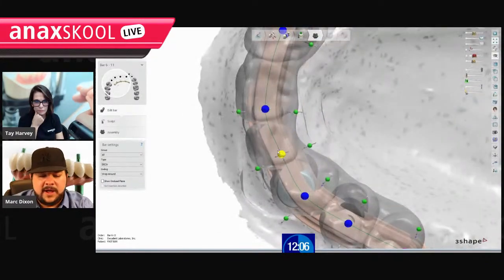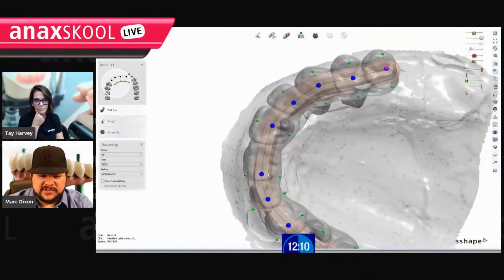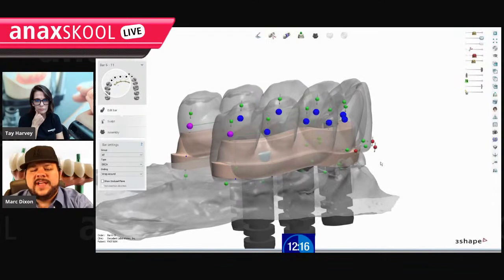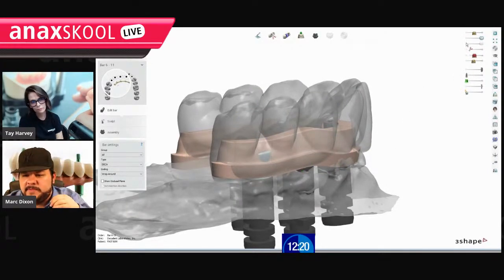Everything was looking good. I'm like, oh yeah, because I finished, I got what I wanted. It was just not a fit. It was not going to fit ever. So pretend you got your bar real good. The reason I like this profile, we lined everything up. Everything looks good. We got our base. We could put the attachments and the abutments on it now.